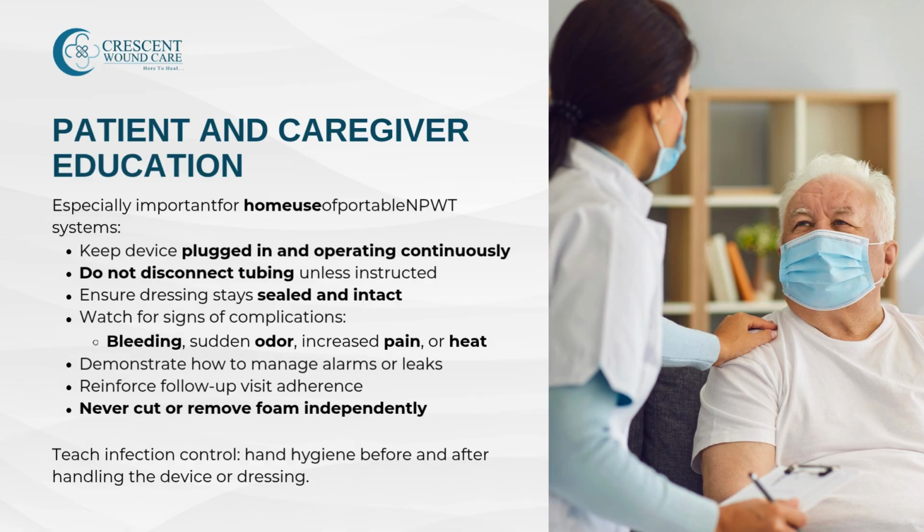Monitor for warning signs such as increased pain, foul-smelling drainage, warmth around the wound, or visible bleeding. Teach them when and how to report concerns. Responding to alarms is crucial. Most NPWT devices have alerts for leaks, blockages, or low power. Go over the basic troubleshooting steps with them.